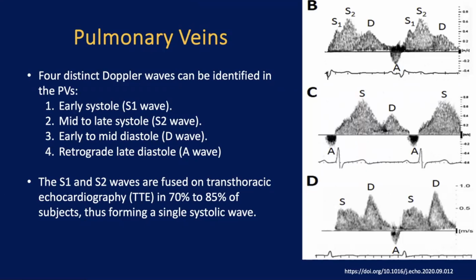Okay, it's good to know these things because it can make sense sometimes when you see it. Yeah, so we add that S1, S2 typically is what we see in a transesophageal echo, much more than transthoracic. We typically see this in a situation when the atrial pressures are very low. Then you can see both. The right-sided pressure is low, and typically in patients with TE, we dry them out and also we NPO them. That's why we could see that on TE more often than transthoracic.